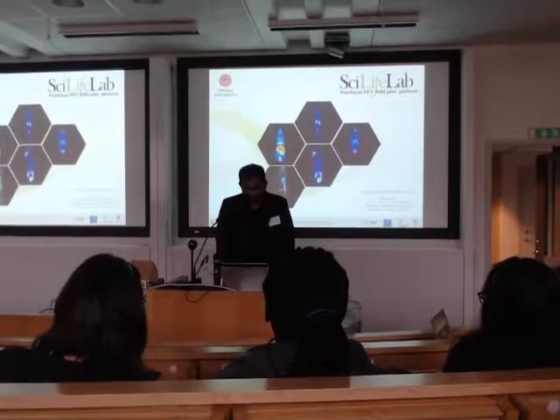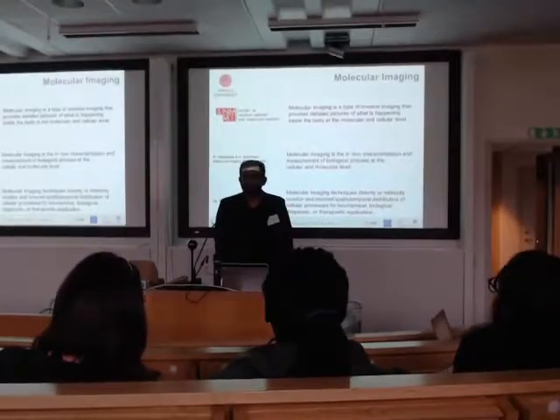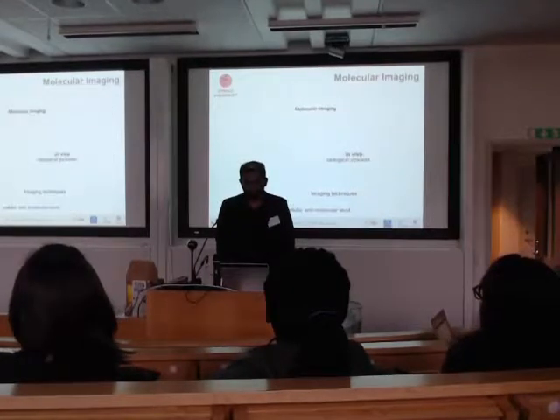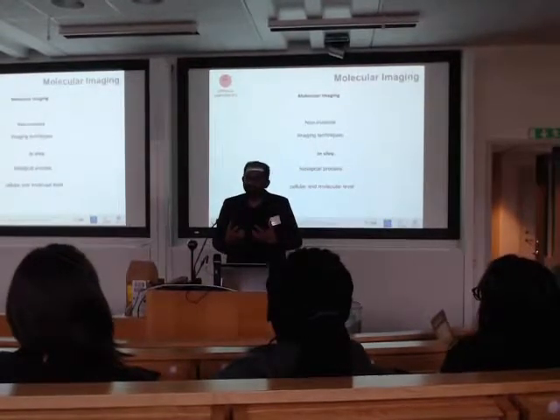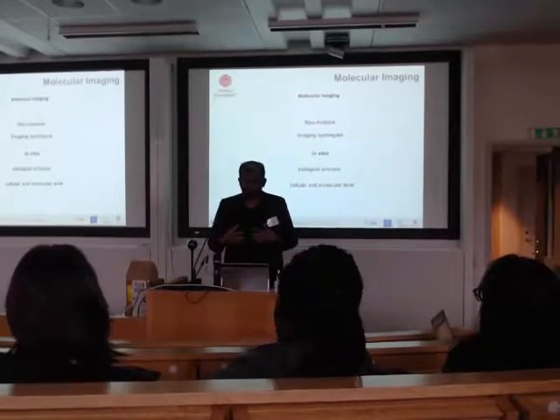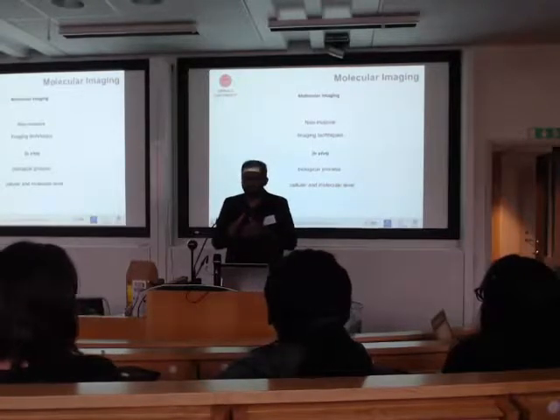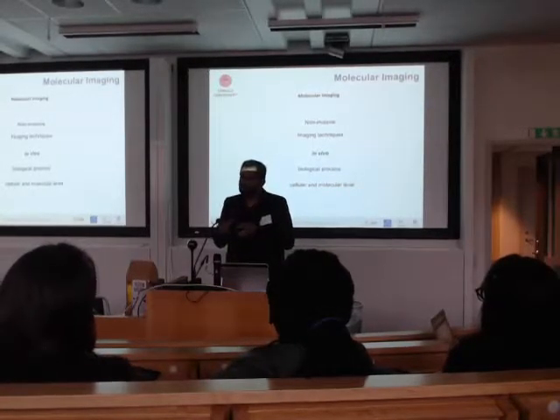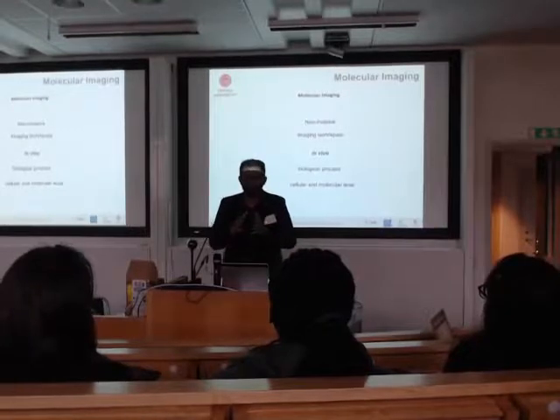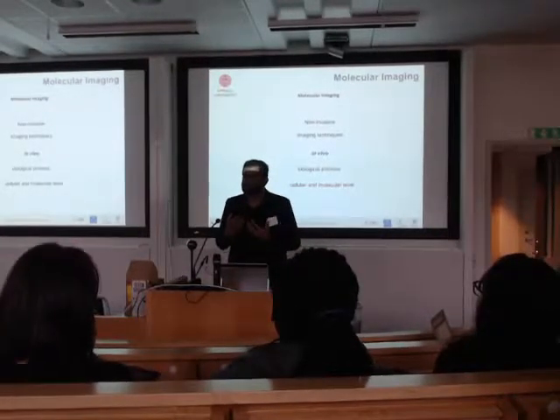So we focus on the concept called molecular imaging. What is molecular imaging? In short, it's a non-invasive imaging of in vivo biological processes at the cellular or molecular level. I would like to emphasize the part in vivo, as in we would like to image the biological processes in a living subject. Can it be a mice, rat, whatever it is, but we are interested in looking in a system which is alive.